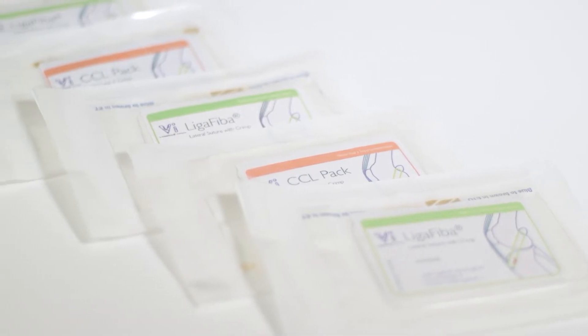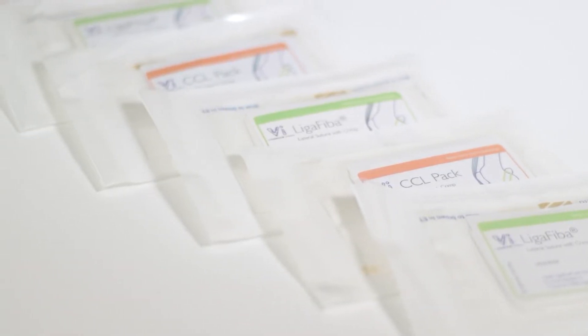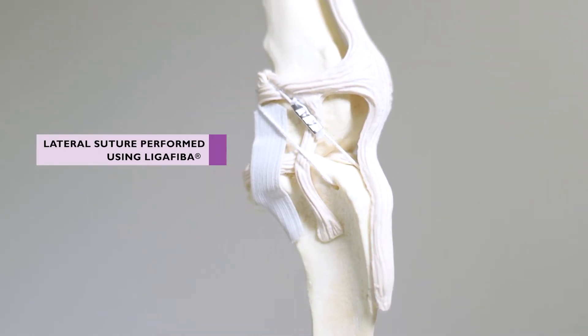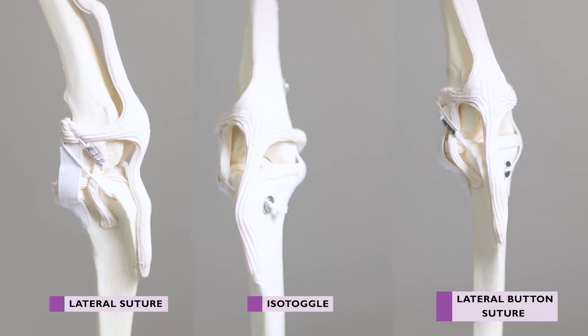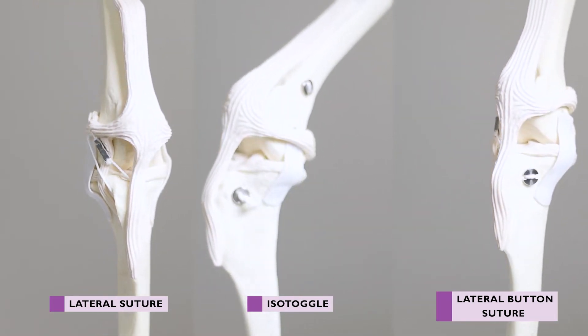Nylon and LigaFiba are popular products and they can be used across a range of orthopaedic procedures. Their primary application is in the lateral suture procedure to stabilise the stifle joint following rupture of the cranial cruciate ligament. LigaFiba is also commonly used in hip toggling procedures. In this video, we will focus on the use of LigaFiba and nylon as implants for extracapsular cruciate repair techniques, since this is their primary application.